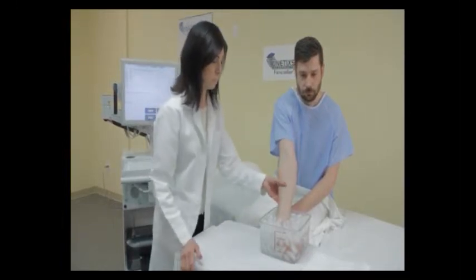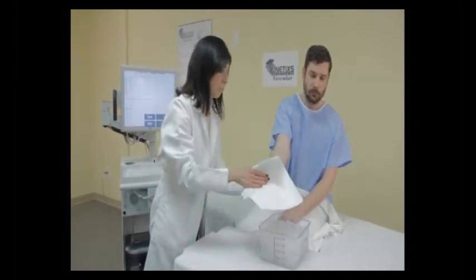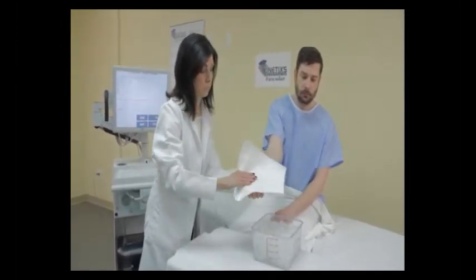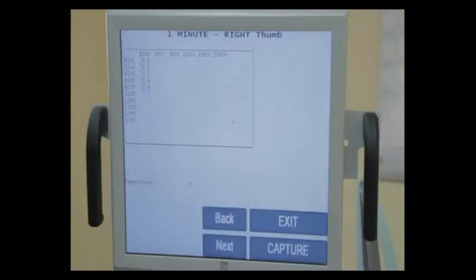After the period of immersion is up, have the patient remove his hand from the ice water bath and gently pat it dry. You do not want to rub this, as the friction from rubbing affects the temperature sensor. You can see the difference here: 56 versus 79, 55 versus 78, 58 versus 73, 59 versus 73, and 58 versus 72.